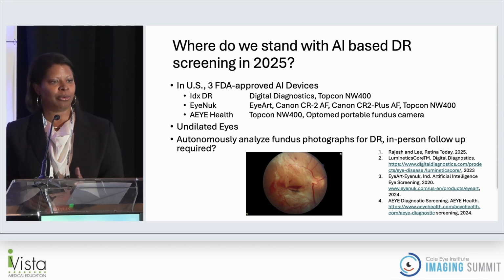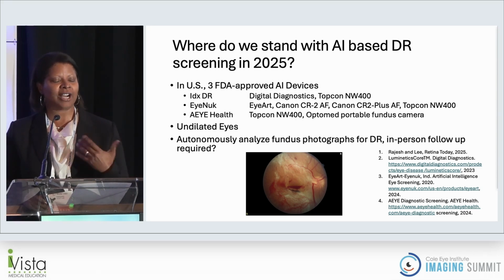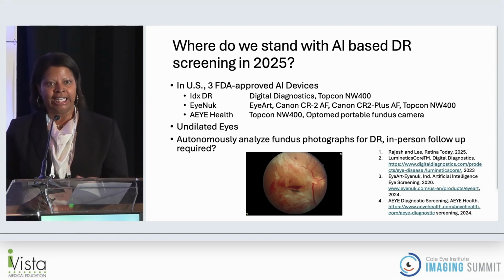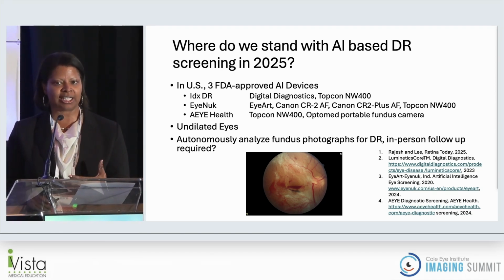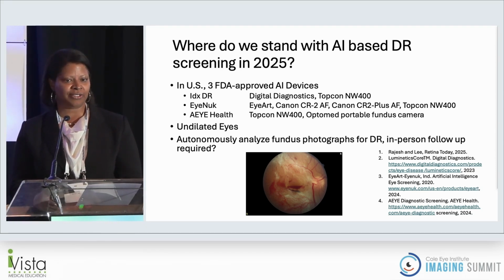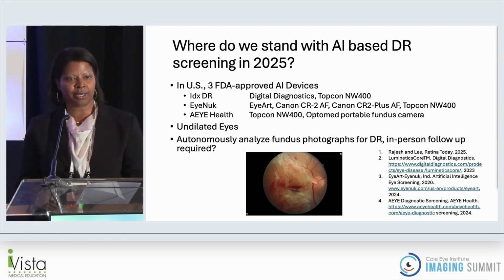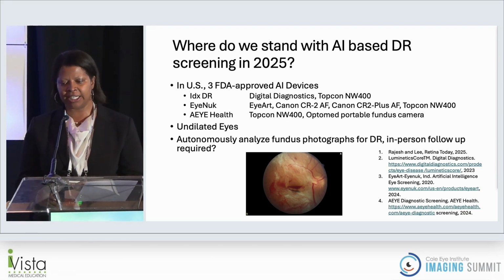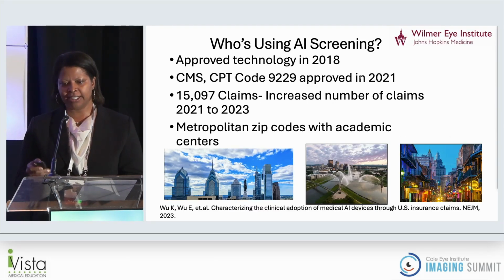One of the major points of AI screening in diabetic retinopathy is to be able to say whether in-person follow-up is required. So it gives an initial diagnosis, but one of the points of the system is to say whether or not the patient needs a higher level of follow-up, or at least a face-to-face exam with an ophthalmologist, hopefully a retina specialist. A lot of what I'm going to talk about is from a very nice review by Dr. Lee that was given in Retina Today.